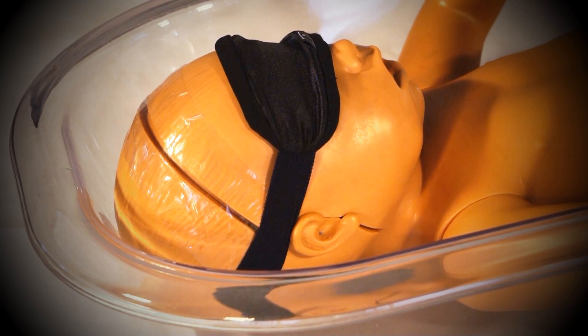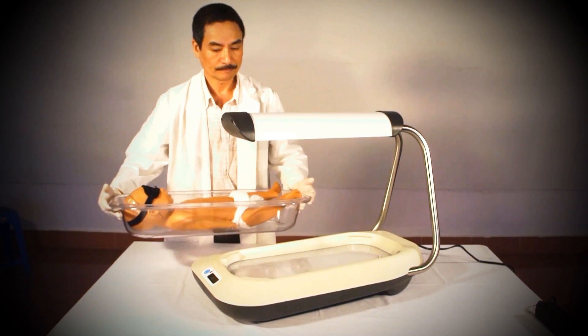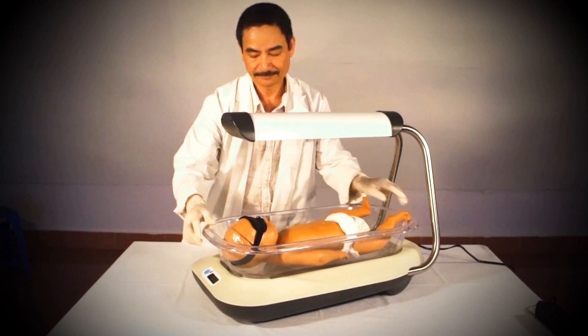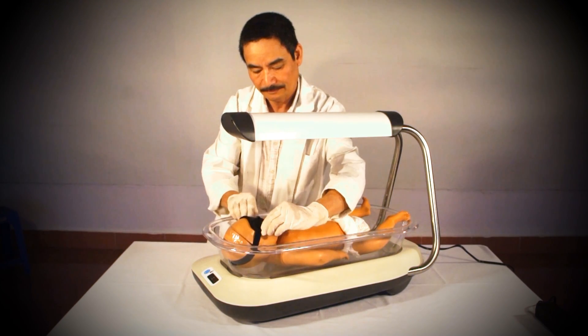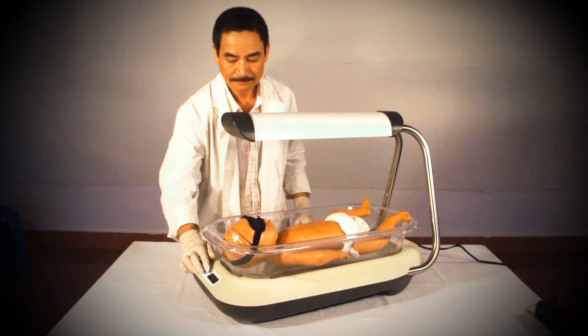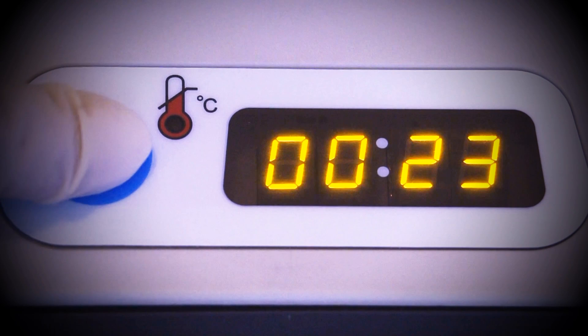The baby is now ready for phototherapy. To initiate treatment, place the bassinet back onto the unit. Make sure that the bassinet is securely in place and that the baby's eyes are still well covered. Turn the Firefly on by pressing the blue power button on the front of the main unit.